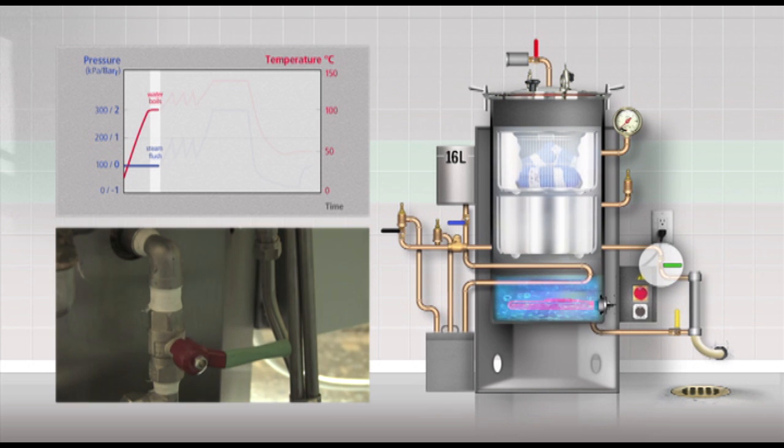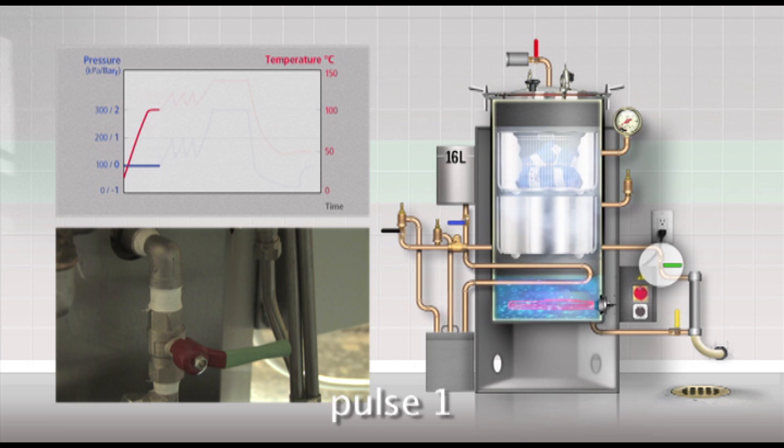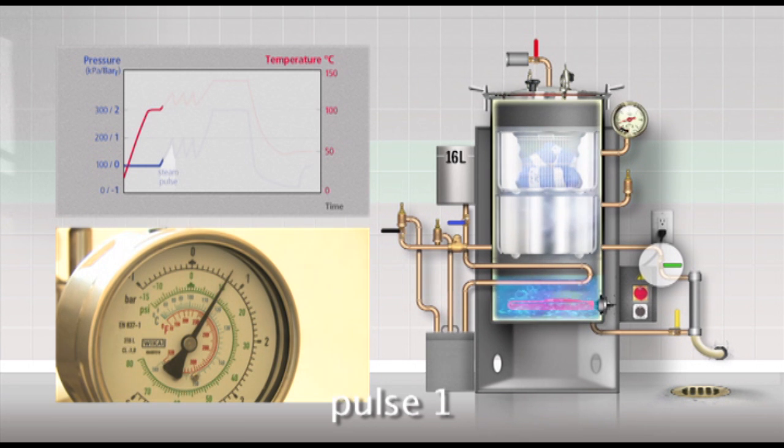Now close the green valve. This is the air removal or pressure release valve. The pressure in the chamber will start to rise. Watch the manometer.